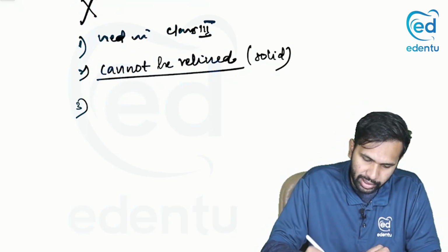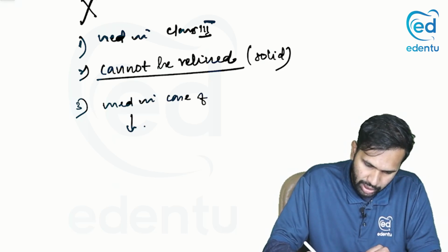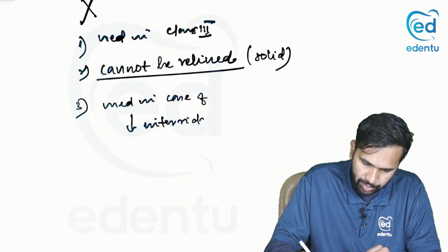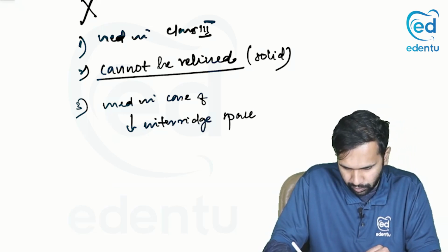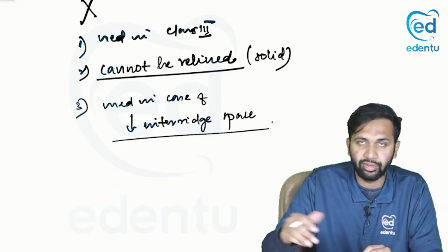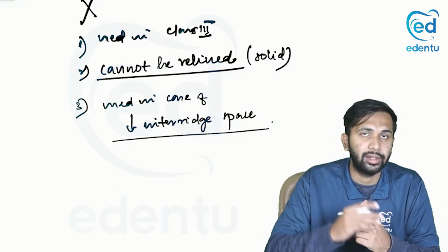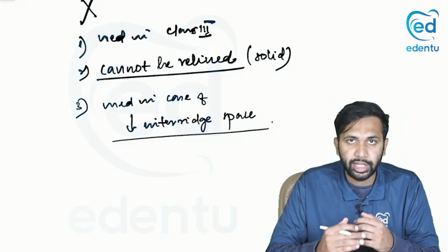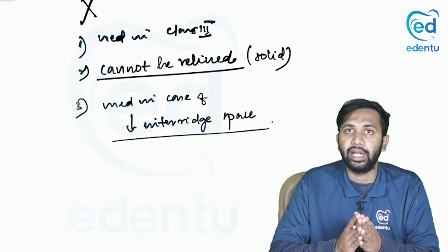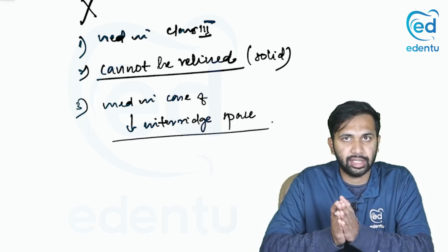And lastly, it is used in case of reduced inter-ridge space. Because it is solid, the acrylic does not have to flow inside and lock it. You can use it in reduced inter-ridge space. It is thinner. Alright. So these were the 3 different types of minor connector which joins the denture base to the major connector, with their features.